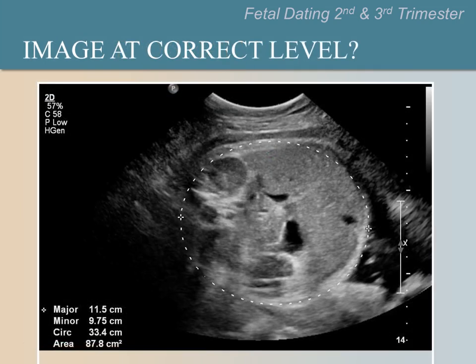Please ask another participant to identify the umbilical vein, stomach, and spine. Then please answer the questions. Is the ellipse position correct? And is the abdomen round? Please pause the video now to discuss. We have now labeled the structures, but what is this?